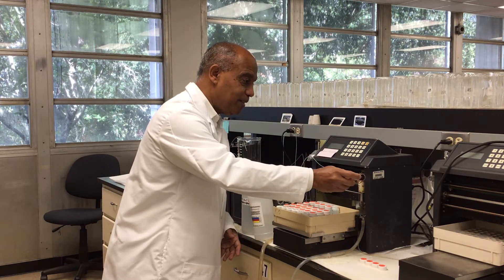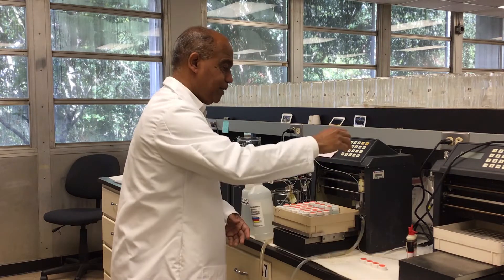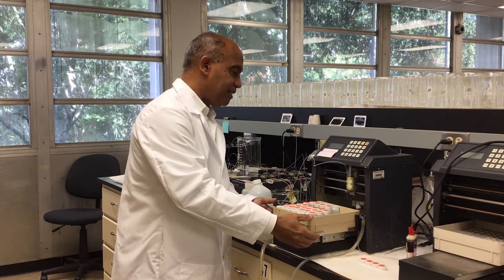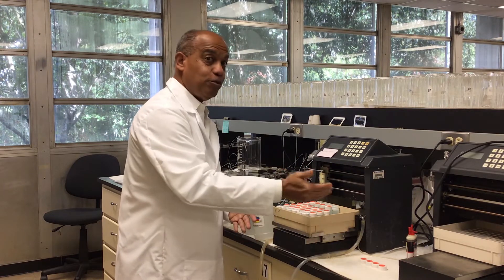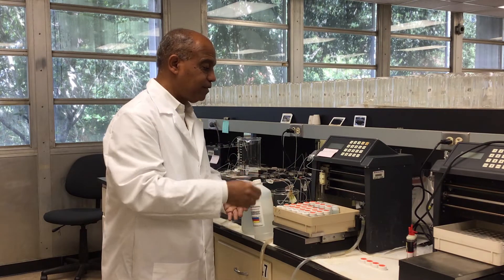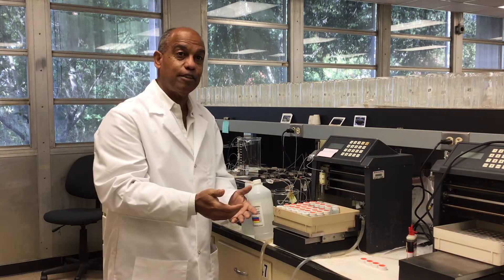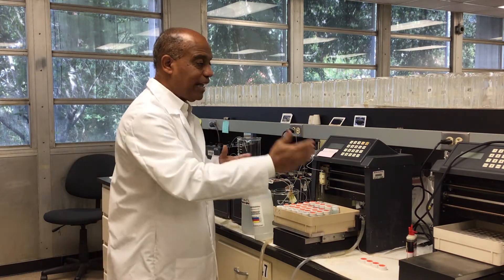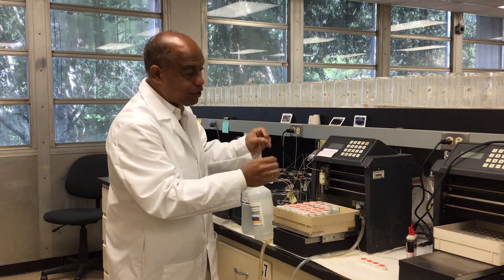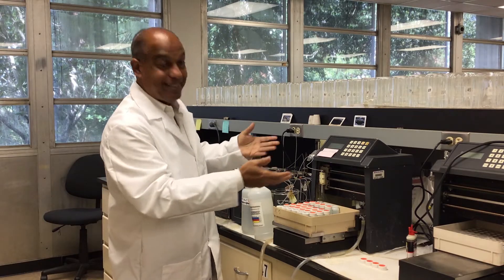We use WD-40 — very useful. You can see the arm just went from here to here; we have to keep it going. It's now picking up a sample and sending it through the machine to get results. We have many different moving parts in here and we have to make sure they're all working and well maintained.